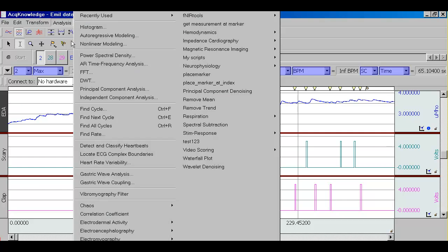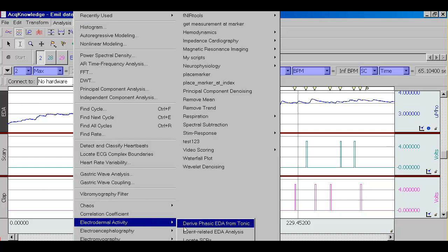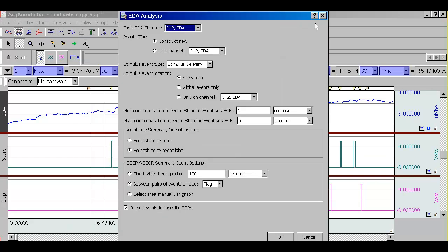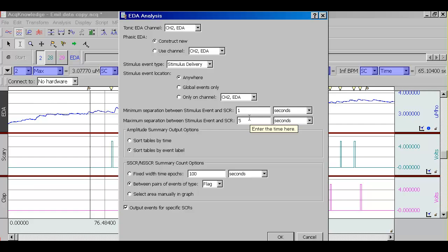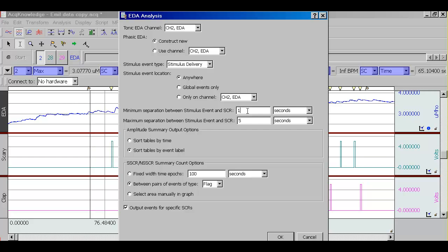We can go ahead and run the electrodermal activity analysis. There's still more settings here. We can specify which channel of skin conductance we're using and whether to construct a phasic signal or use your own. Then we can specify the stimulus event type. In this case, it's stimulus delivery. This here allows us to specify the minimum and maximum separation between the stimulus event and the onset of skin conductance response. If a skin conductance response occurs 100 milliseconds after the stimulation event, that's physiologically not possible. This allows you to rule out responses that occur too early or too late after the stimulation events, and they will not be considered specific to the stimulation events.